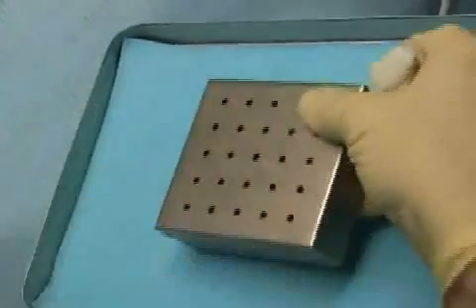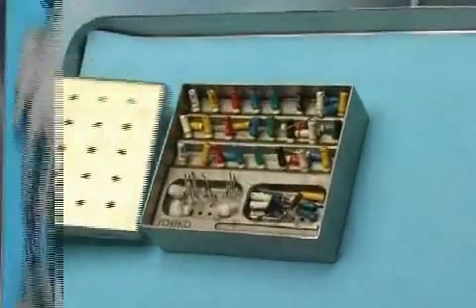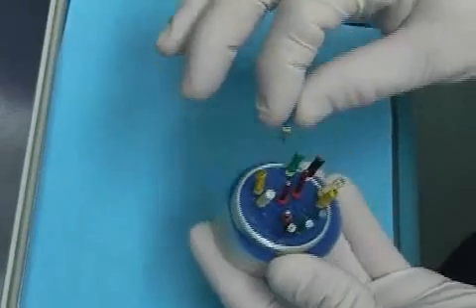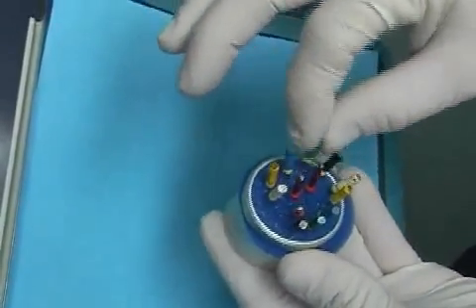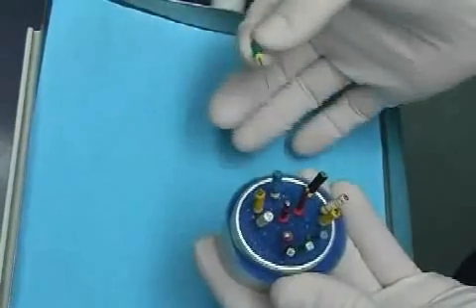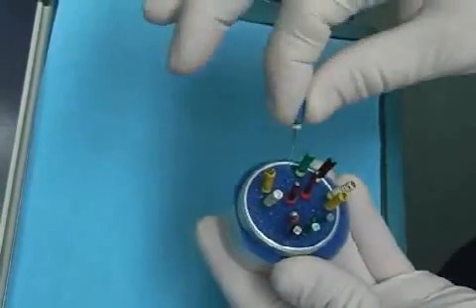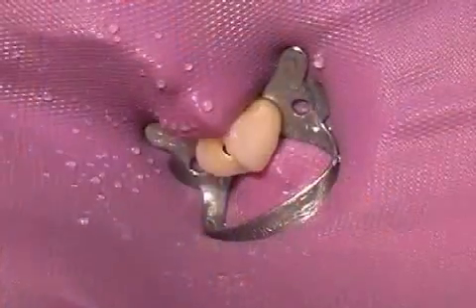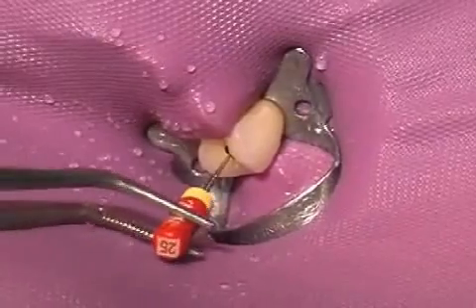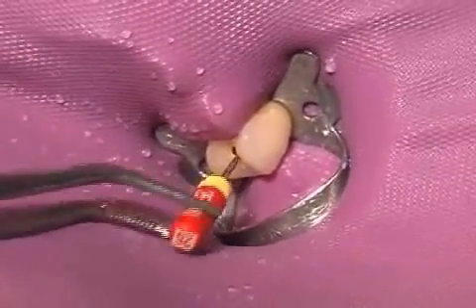The various instruments are neatly arranged. However, in far too many cases, root canal work is performed with unsterile instruments — instruments placed openly in simple foam rubber racks as seen in the image. With the aid of sterile instruments, the dentist can begin to clear and clean the interior of the tooth. Special solutions are used intermittently for rinsing in order to remove tooth chips, cell debris, and bacteria.